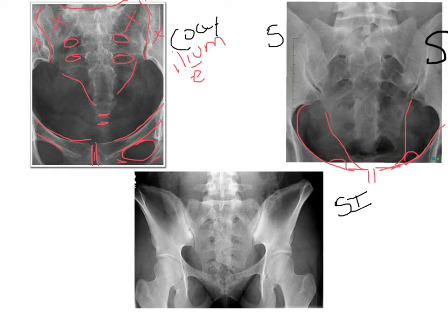So how do we know that we've angled correctly? We've got the correct amount of angulation and we've angled the right way, cephalically. Well, we look at these sacral foramina. Do they appear open? And are they free of superimposition from the pubis symphysis? In this case, they are, but we've clipped some important anatomy, so we would need to redo this image. Plus, we're missing a marker. Don't know if we're looking at right or left here.